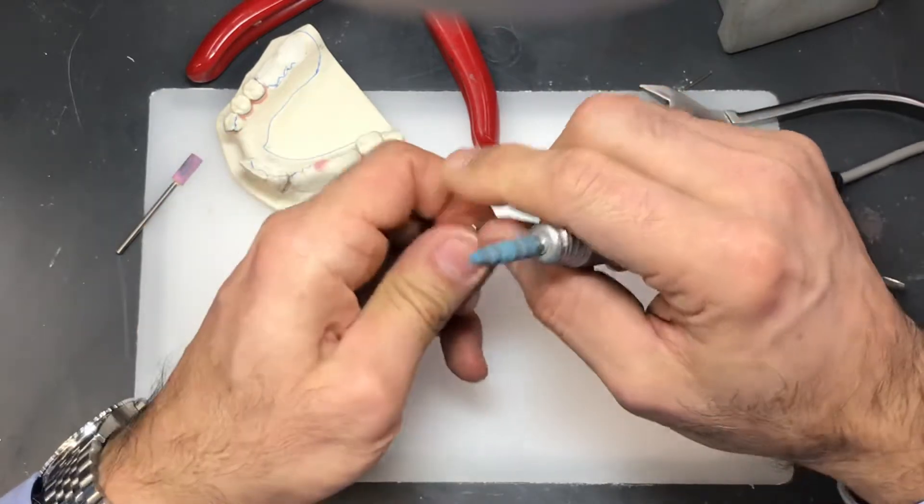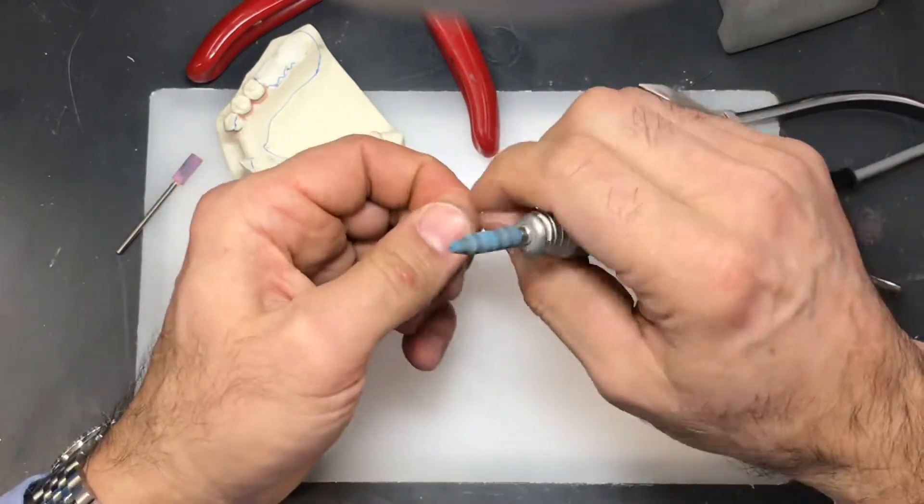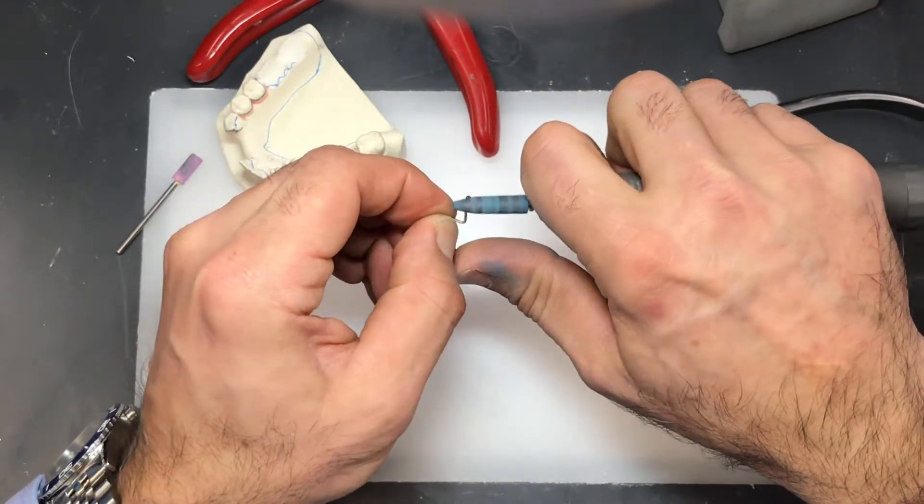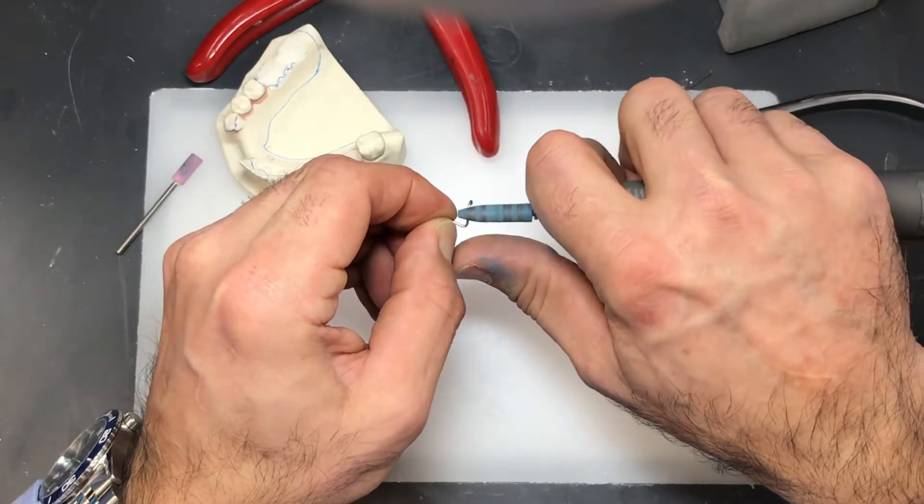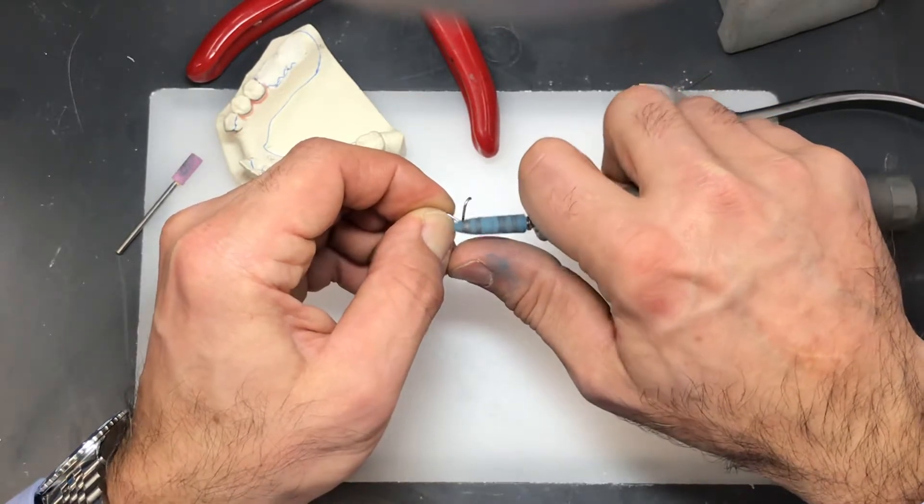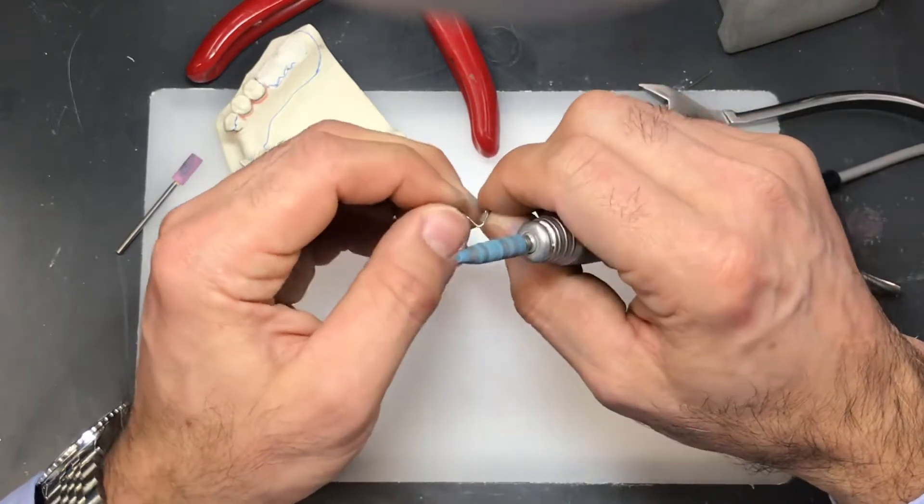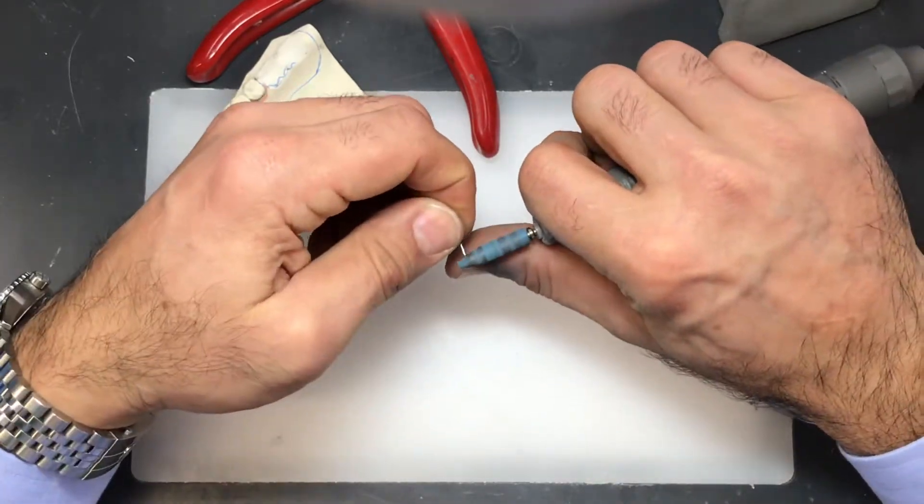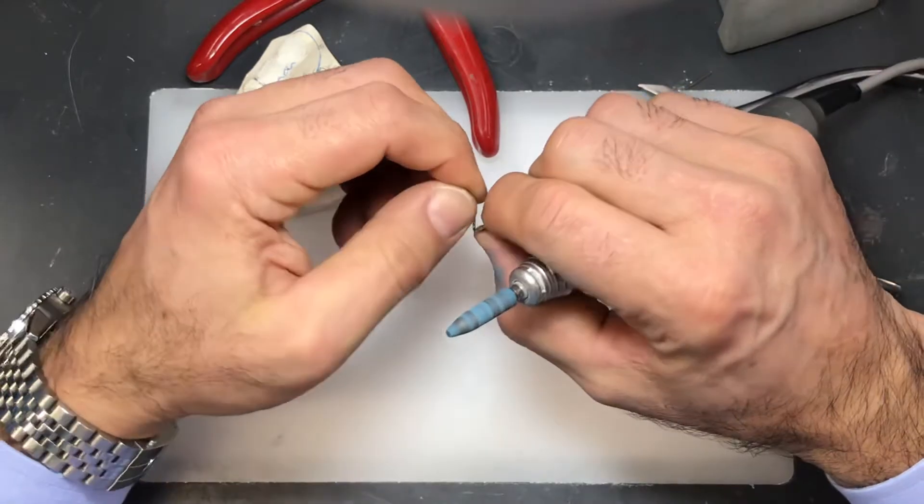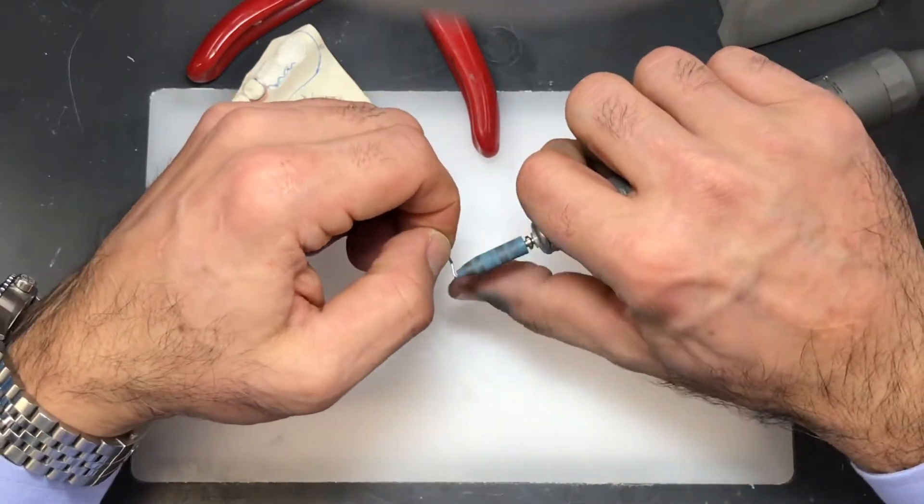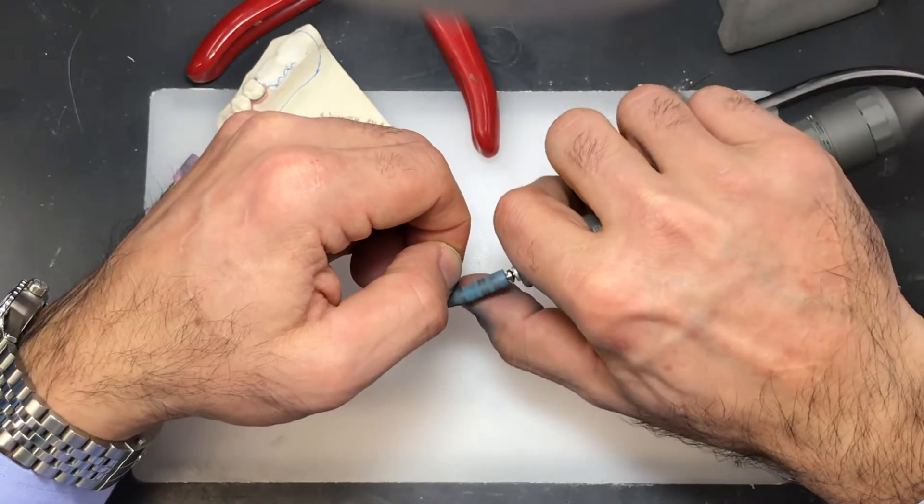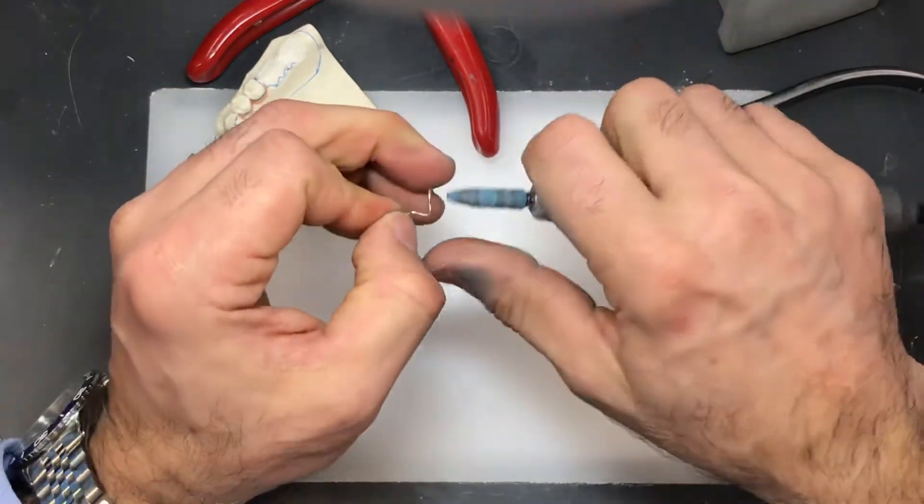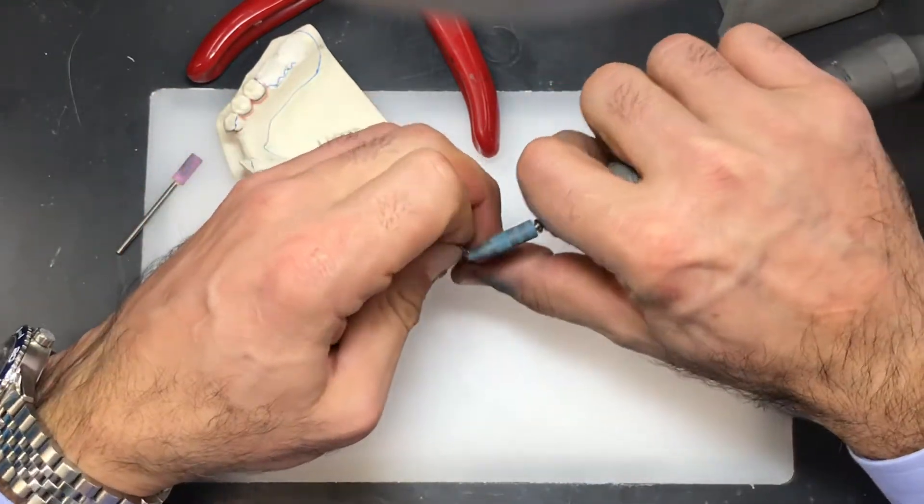You need to polish the wire with a rubber point to get rid of the little nicks. Keep in mind the more you start adjusting this wire or polishing this wire with a rubber point, you're making it smaller and smaller in diameter.